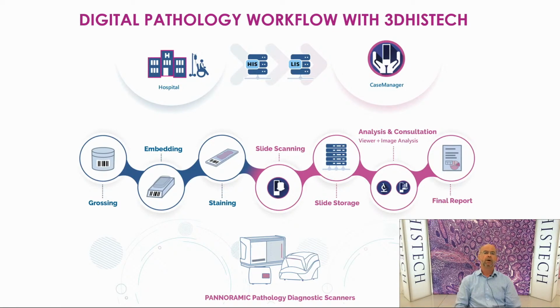In 2021, digital pathology entered a new milestone, contributing to the development of pathology. And this is the digitization of the pathology workflow. And this workflow surely is not only linked to the pathology department itself. Surely the specimen collection, the fixation, transportation starts in the hospital environment, and also the clinical data, the patient data, are transferred to our pathology lab.